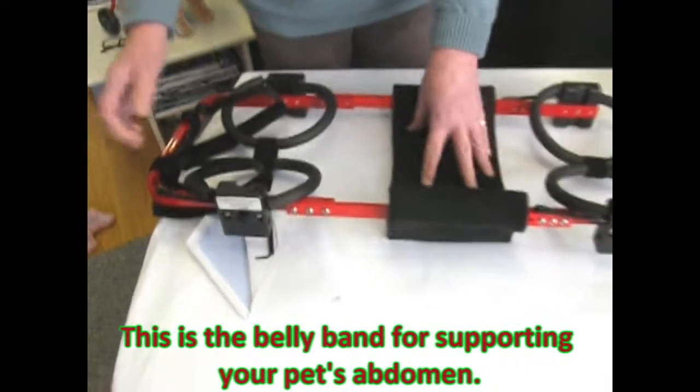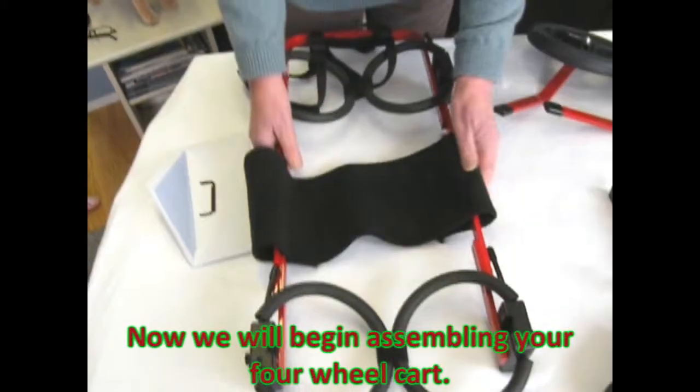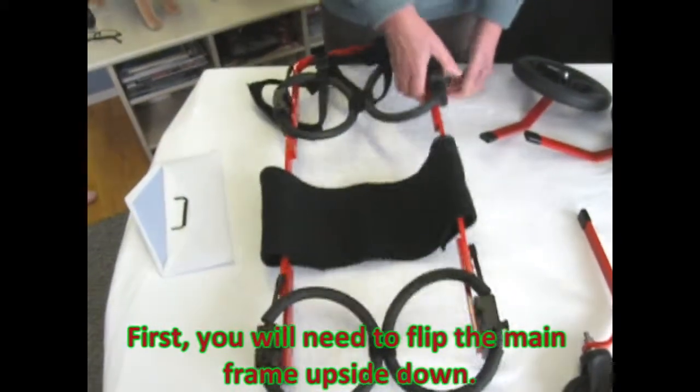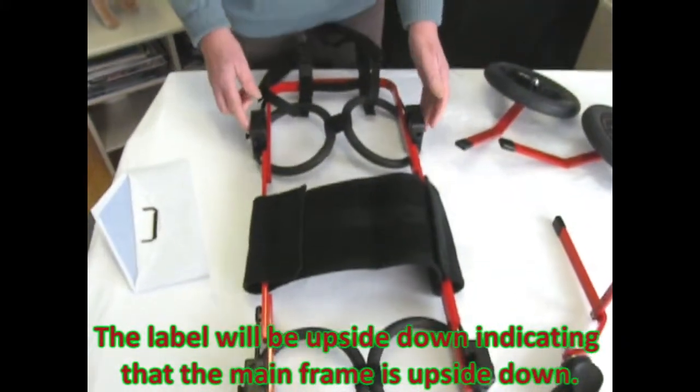This is the belly band for supporting your pet's abdomen. Now we will begin assembling your four-wheel cart. First you will need to flip the mainframe upside down. The label will be upside down indicating that the mainframe is upside down.